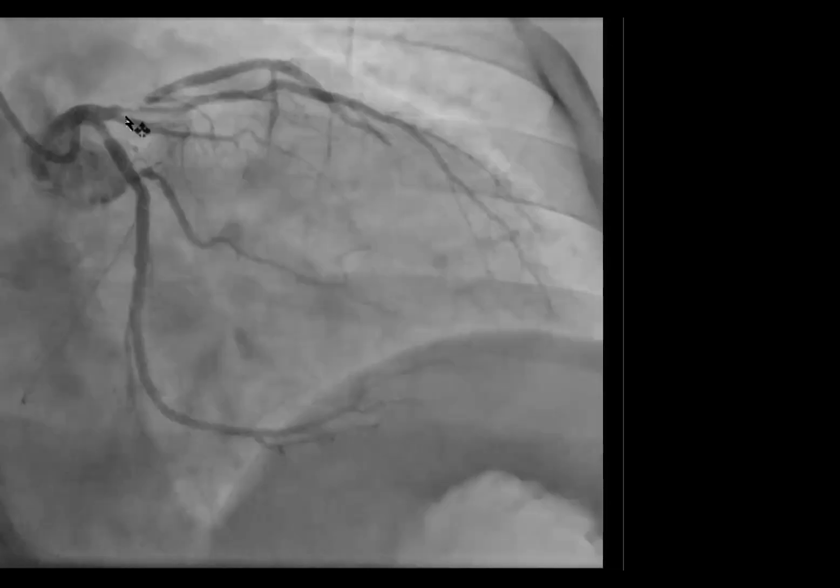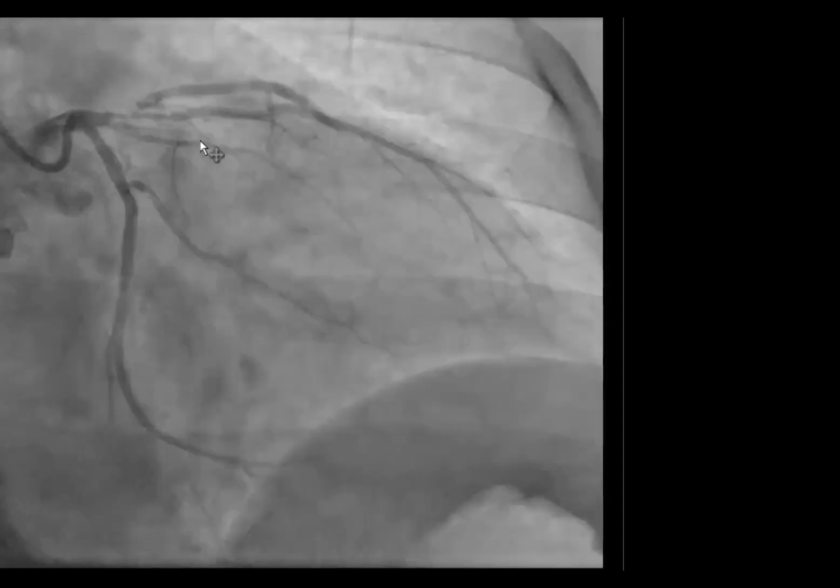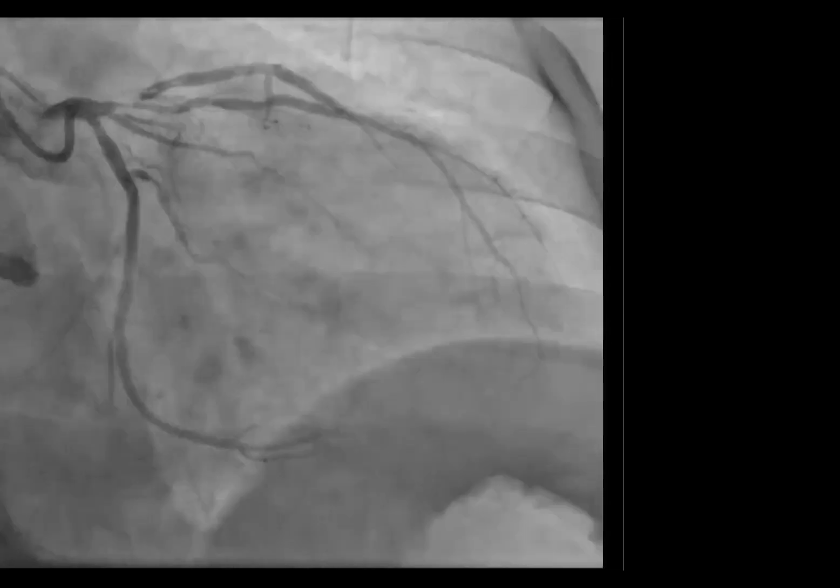Then just on the side, there's a diagonal with a LAD coming off. My initial thought was this is probably a thrombus.